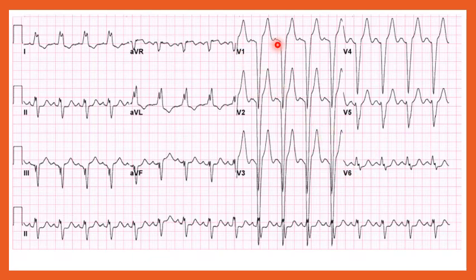And I can see pretty quickly looking at V1 that QRS complex is wide. So I'm going to be searching for a bundle branch block, am I not? I am definitely searching for a bundle branch block. And so I'm seeing that this QRS is minimally 0.12 to 0.14 seconds.